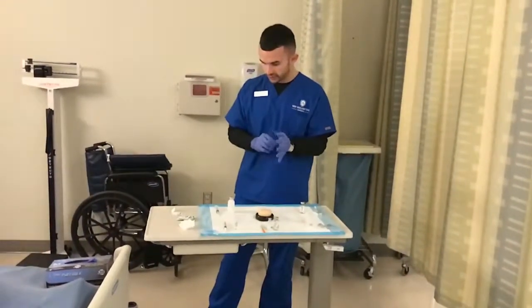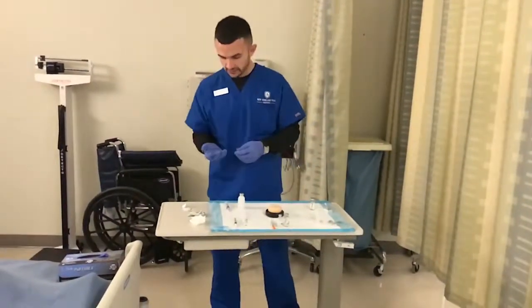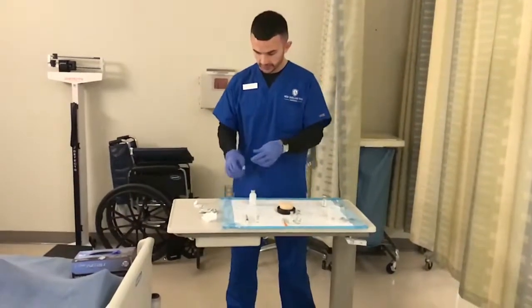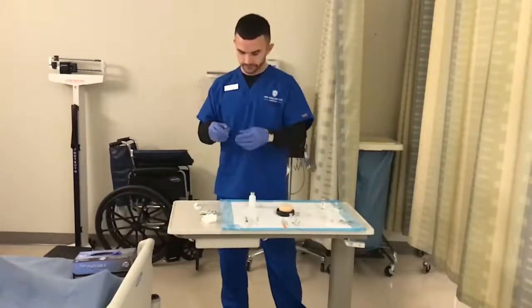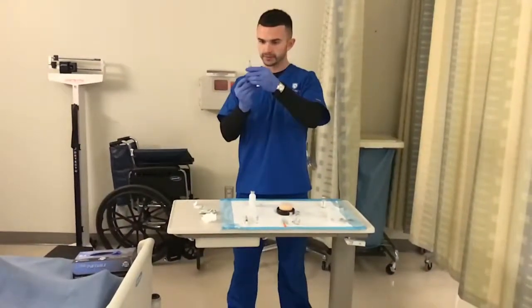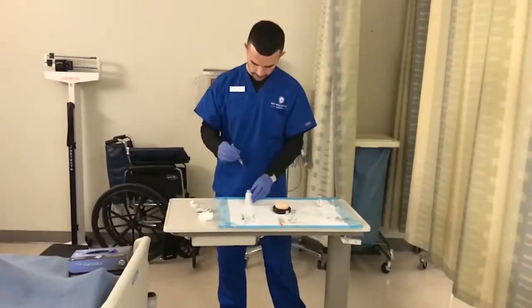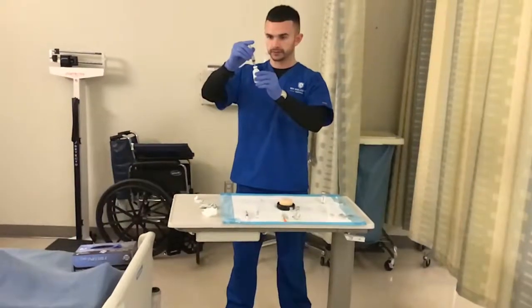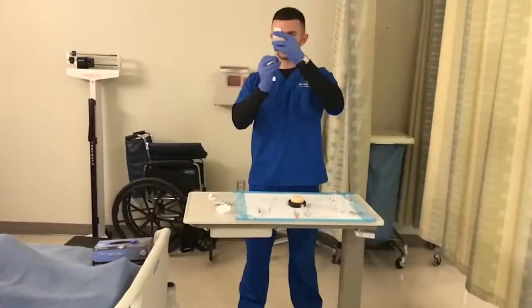So next, I'm going to move to my IM injections. And again, the best site is the ventrogluteal, or the deltoid is also used a lot. So again, I would cap off my needle. We would draw up, we'll say 2 milliliters for this one. Insert 2 milliliters of air into my medication vial. Tip it, and I can draw it up.